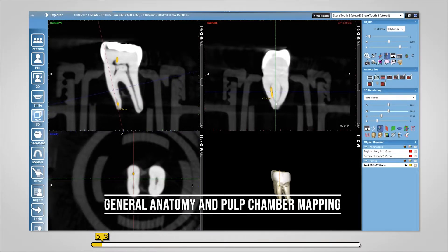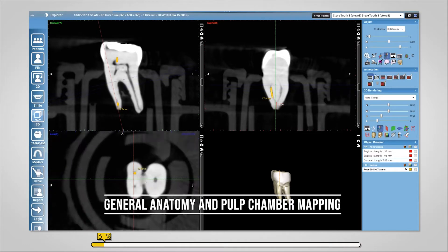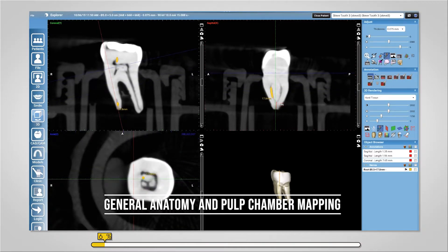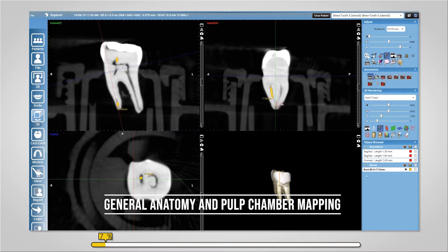Two to three millimeters from your minor foramen, it's very abrupt as well. That's the confluence. You'll also notice some heavy calcifications in the pulp chamber — these are pulp stones, and we'll show you how to remove these.